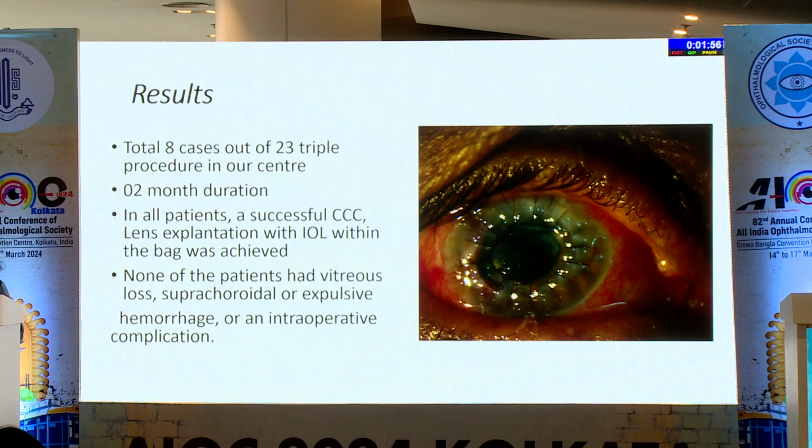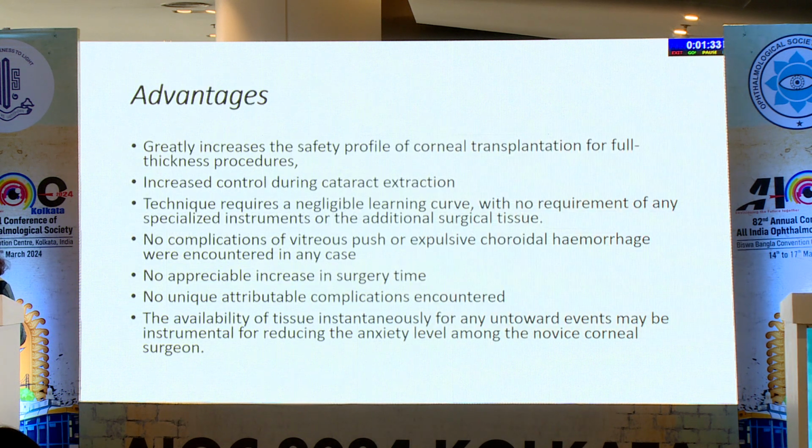The results: I have done 8 cases out of 23 TPK procedures in our center in the last 2 months, and in all patients successful CCC and lens explantation with IOL in the bag was achieved, and vitreous push and pressure were not observed. There was no complication throughout.